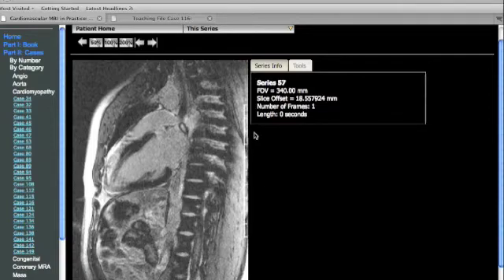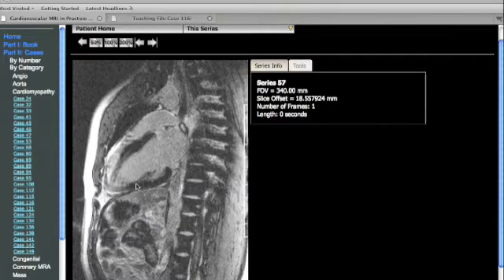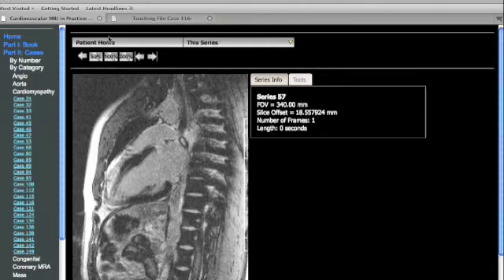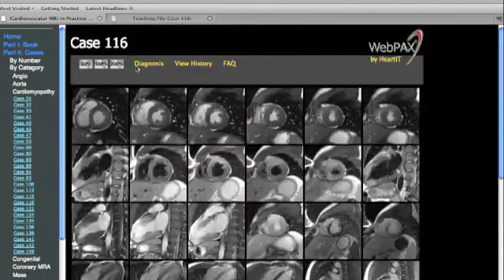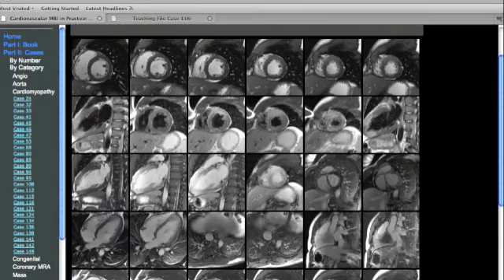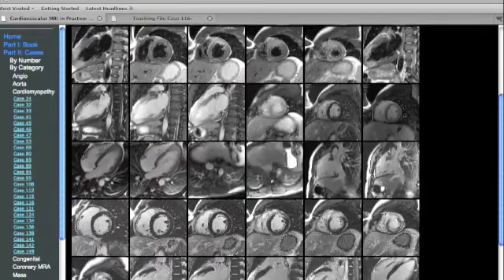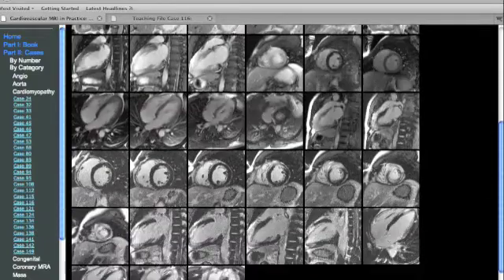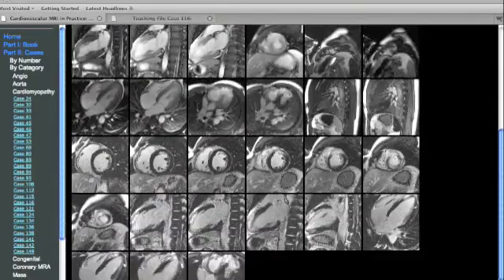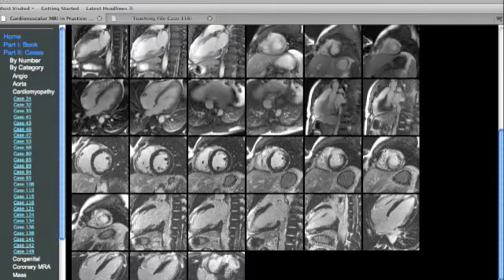In evaluating these delayed enhancement images, the first distinction that needs to be made is between a coronary artery disease-related pattern, which universally involves the subendocardium, versus the non-ischemic patterns, which often spare the subendocardium. This pattern, in concert with the patchy uptake noted, is entirely consistent with the patient's clinical diagnosis of viral myocarditis.